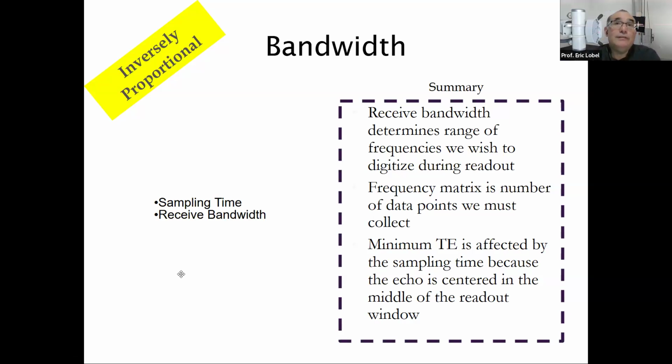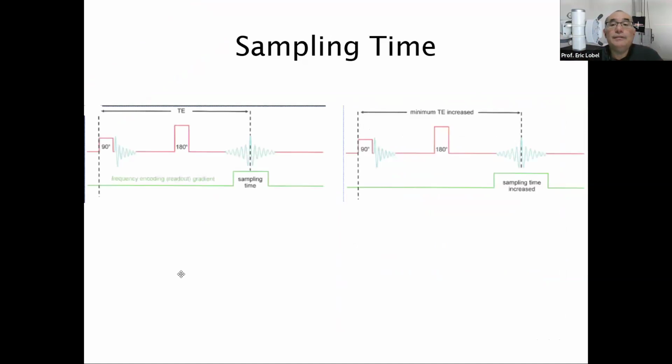But also TE has an effect on weighting. So remember, as we start to learn about these different parameters separately, generally changing one thing has this ripple effect that will affect other areas of signal and thus your overall resolution in any given scan.